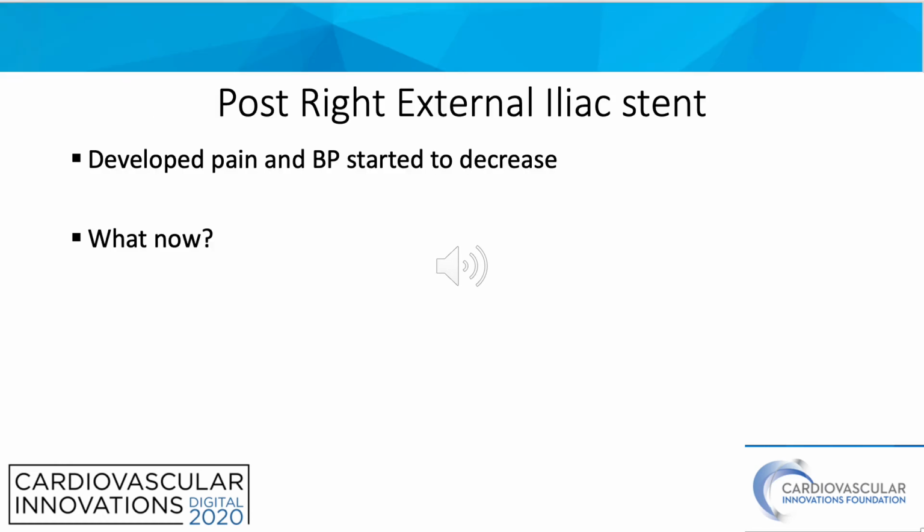As we came down with that balloon, the patient immediately developed some right flank pain, and we could see on our arterial line that his blood pressure started to decrease almost immediately. So what do you do now?